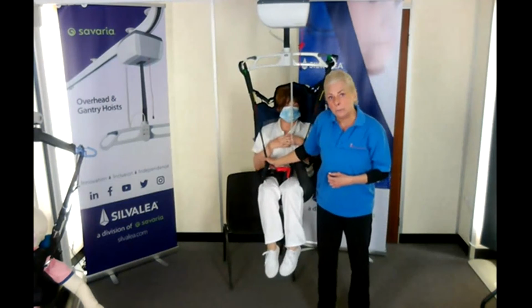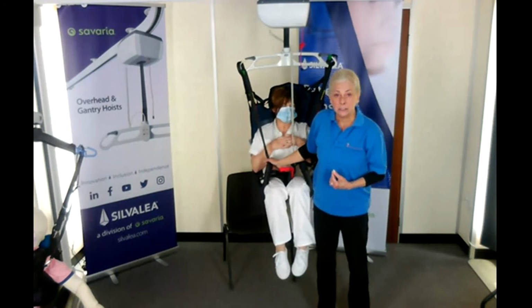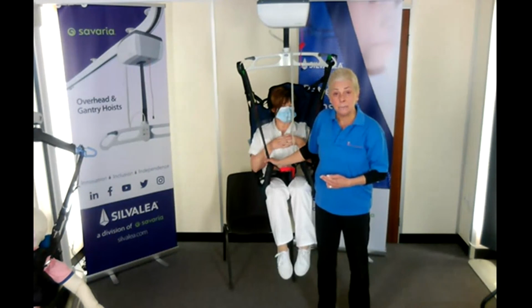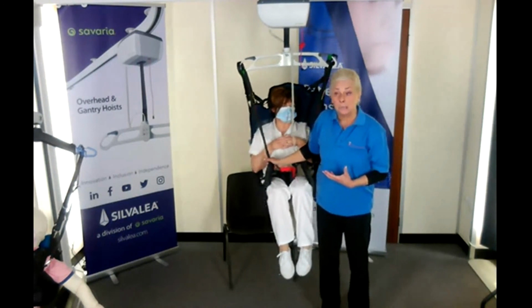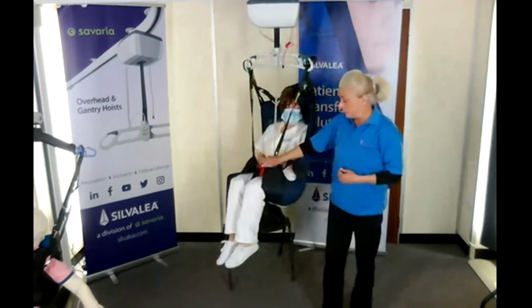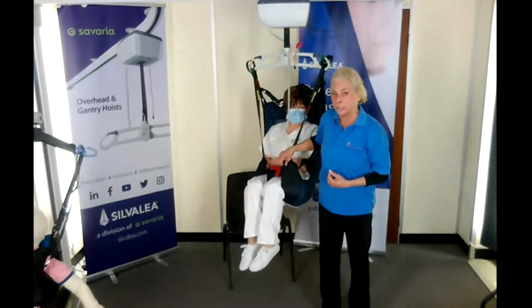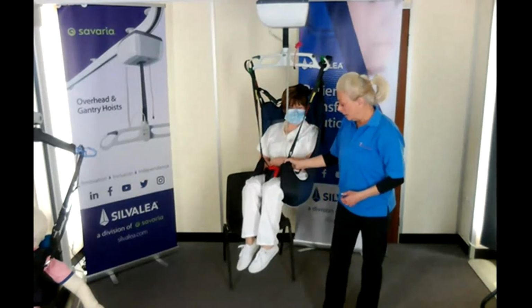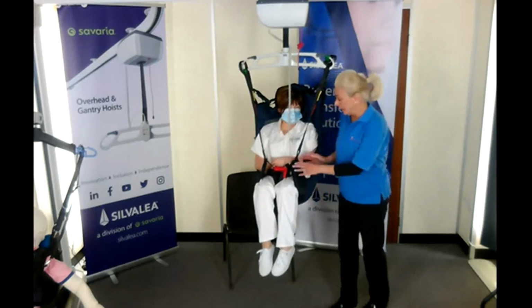There's always going to be people that prefer to take the slings out. You've got to weigh it up. It's a balanced decision as to whether it's easier for all carers to leave the sling in. Think about shearing, getting in and out, but you've still got to weigh up any pressure things that can cause that sort of problem. Fabric choices, sling design. We have got options for you, but certainly you've got to think about all that. But then, we can help. But ultimately, it's a balanced decision by everybody involved.